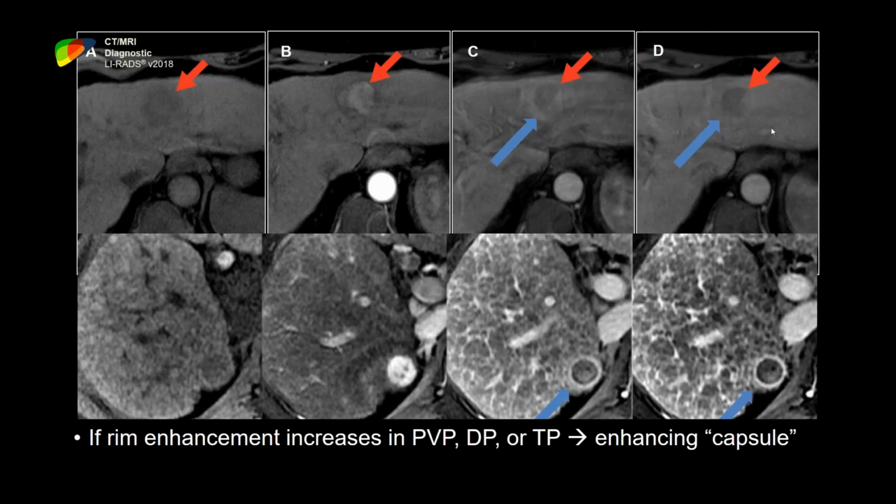There are ways to counter those, including advanced techniques like acquiring multiple arterial phases. There's some data from Sinai that shows that when you do that, you're bound to have at least one diagnostic arterial phase. What we do at Montefiore is we dilute the bolus with normal saline. So instead of injecting 10 cc's of gadoxetate, we dilute it with 10 cc's of normal saline. So you get a 20 cc injection, and it mitigates a lot of motion artifacts.